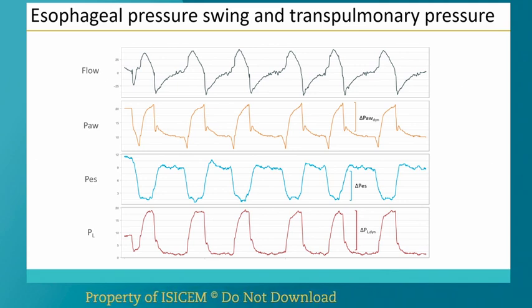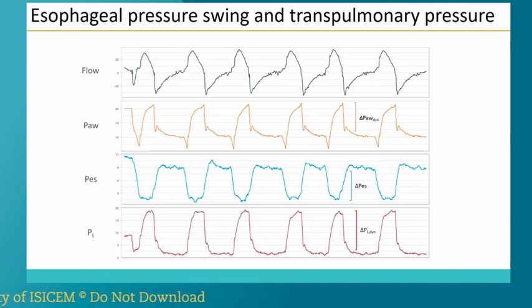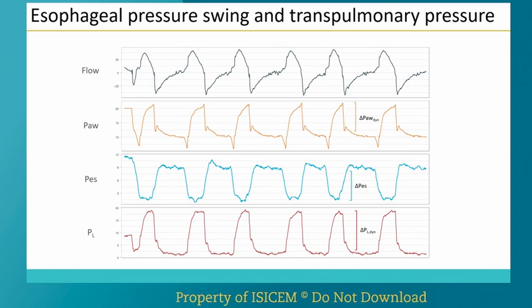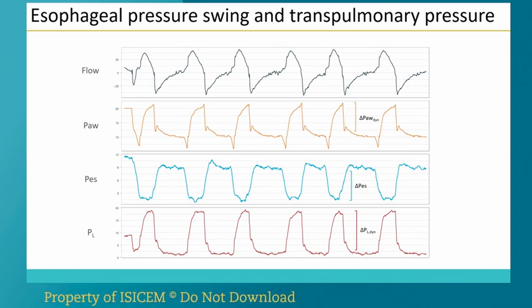And that's because, again, as mentioned previously, this airway pressure doesn't consider the magnitude of the respiratory effort. So placing an esophageal balloon on a patient gives us these two very important pieces of information. It gives us the magnitude of the respiratory effort, which again we can associate to the risk of diaphragm disuse atrophy when it's very small, and to potentially load-induced diaphragm injury when it's very high, and possibly more importantly, it gives us an idea of what the actual lung distending pressure is during a spontaneous breath.